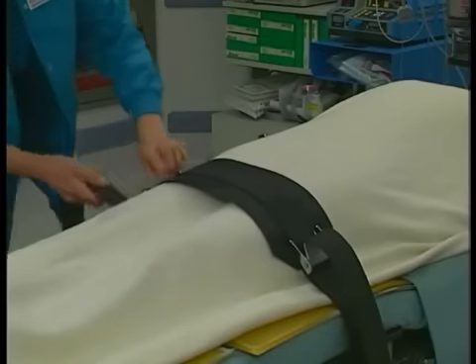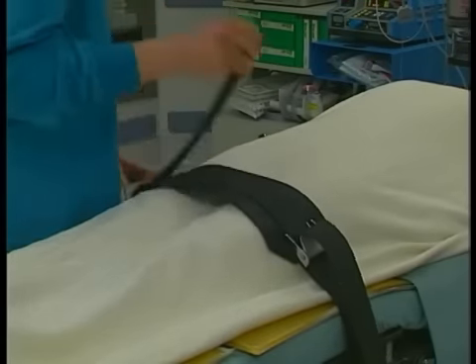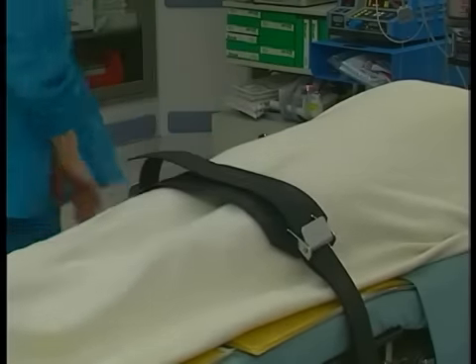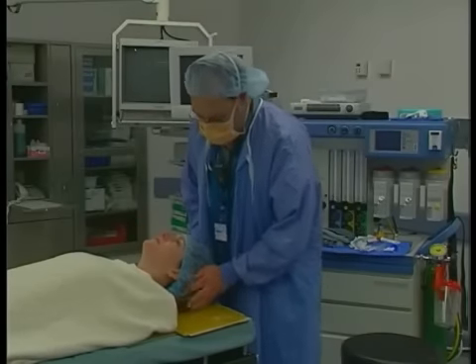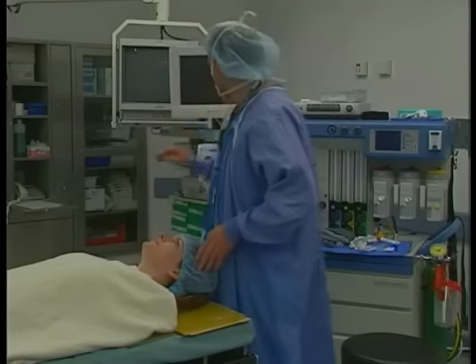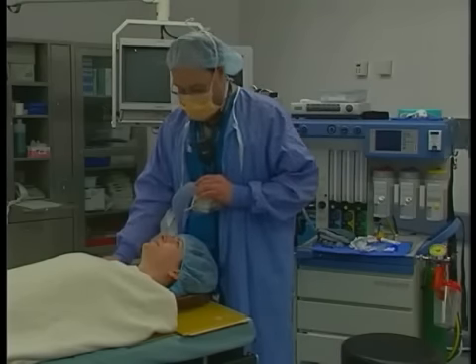The correct placement of the safety belt is about two inches above the knees. Be sure the belt is not too tight as to put undue pressure on the legs. The anesthesiologist is responsible for maintaining the patient's head in alignment. A proper head support will prevent stretching of the neck muscles and maintain the head in a neutral position.